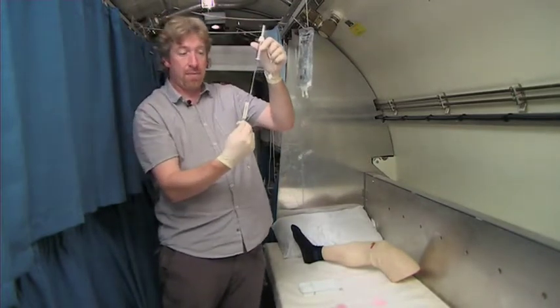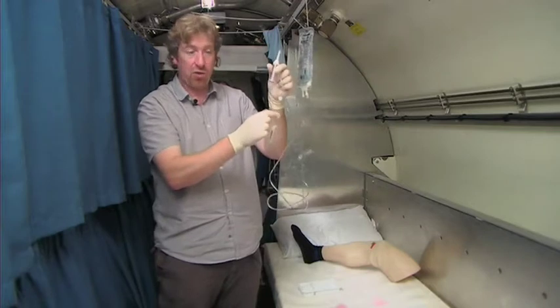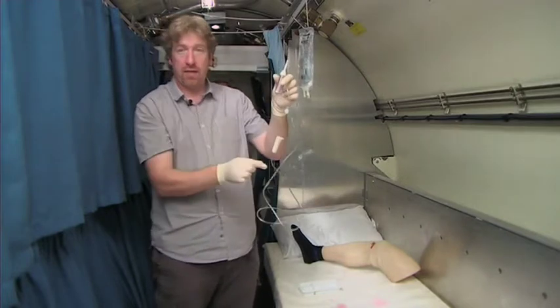There is the clamp which you control the rate of the infusion with — that is always in the open position to protect the integrity of the tubing. So first things first, when you get it out of the bag, you put the roller clamp down so it's locked in.